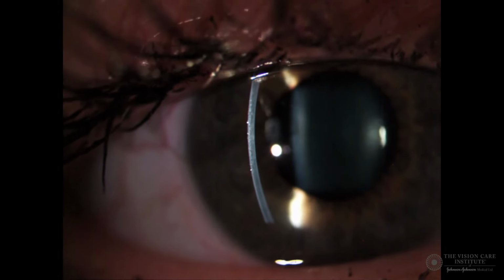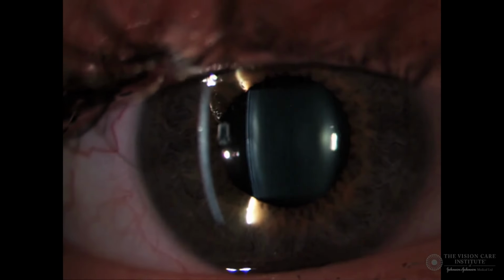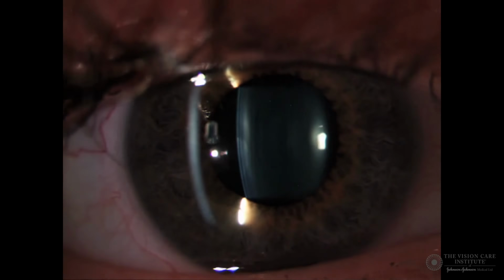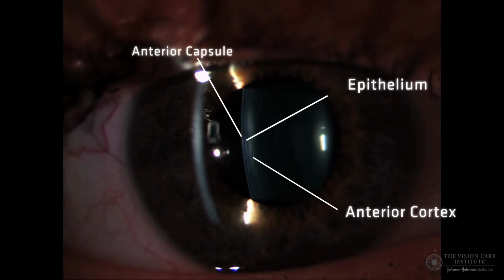Once we've achieved this, we will be able to see the lens out of focus within the pupil. In order to focus the lens, we simply move the whole slit lamp forward, and we can see that this allows the anterior surface of the lens to be seen clearly in focus. In this instance, we can see the capsule, which is the very leftmost bright band, followed by a dark band, and then another bright band, which is the epithelium of the lens, and then a dullish band, which is the cortex of the lens.